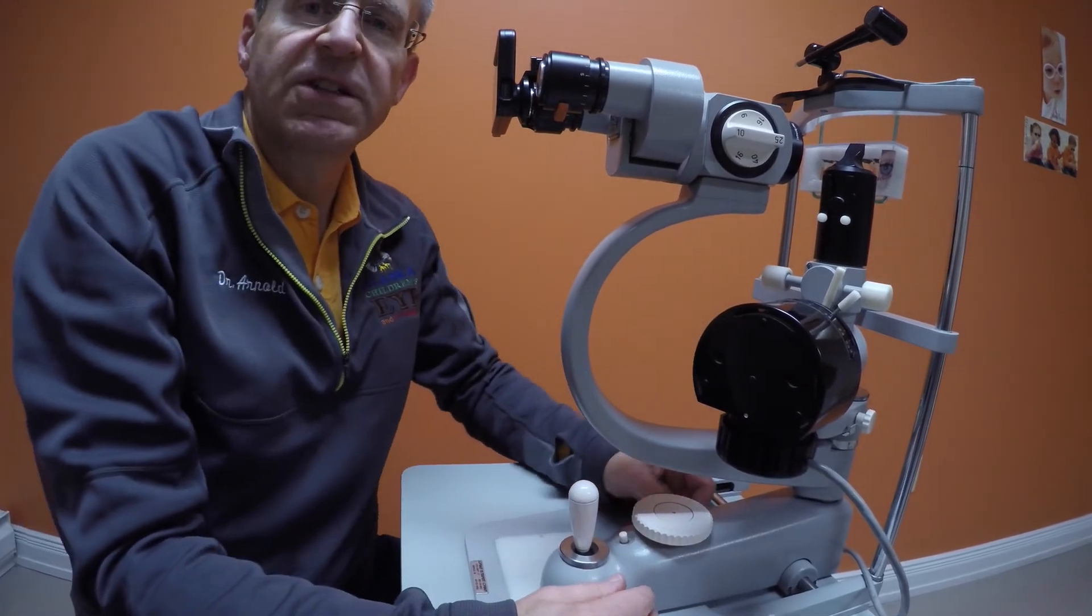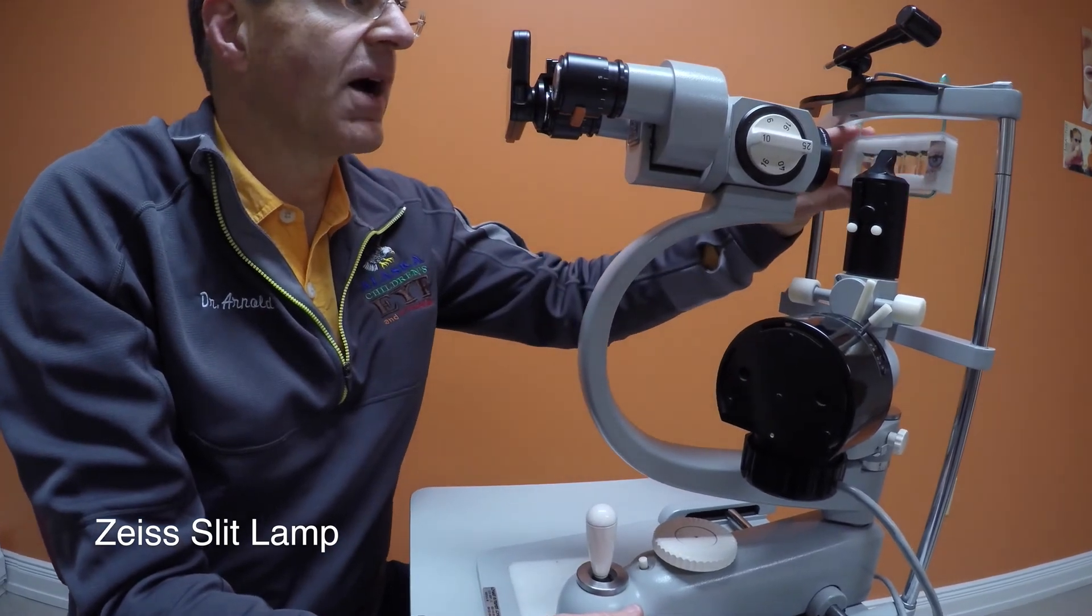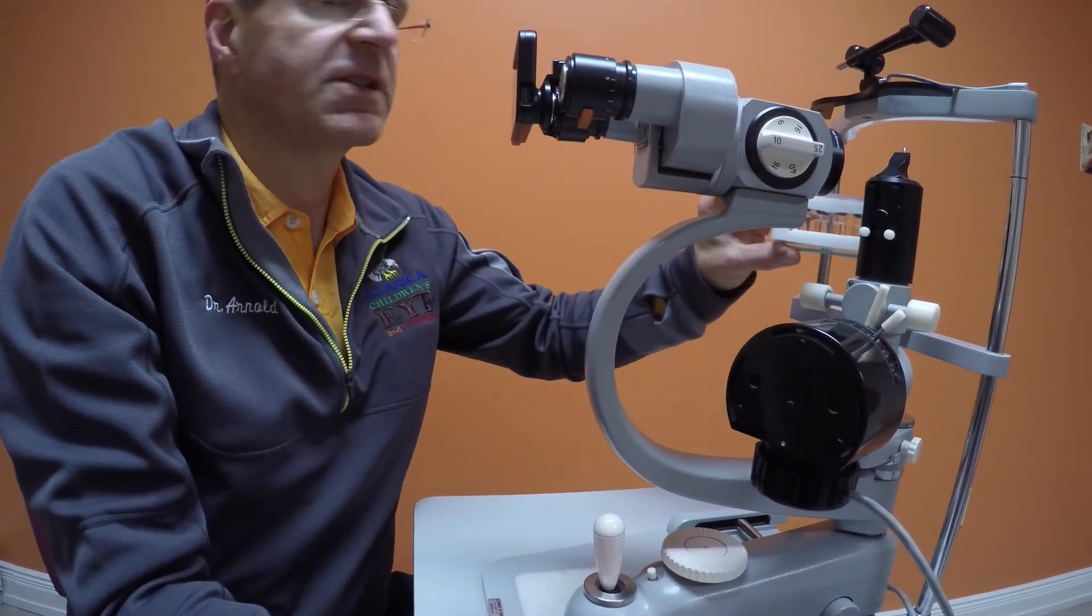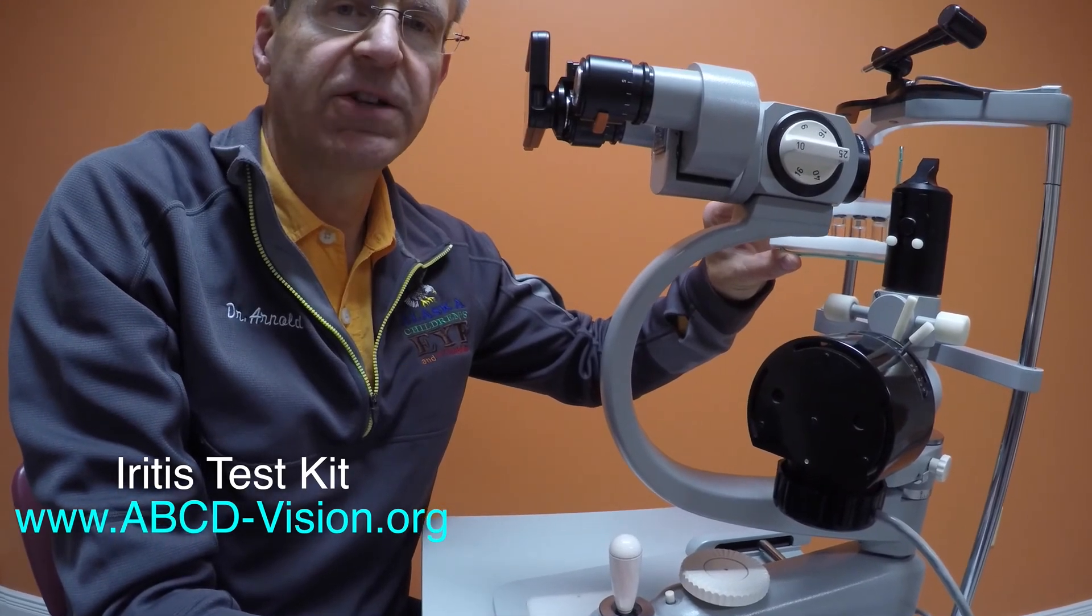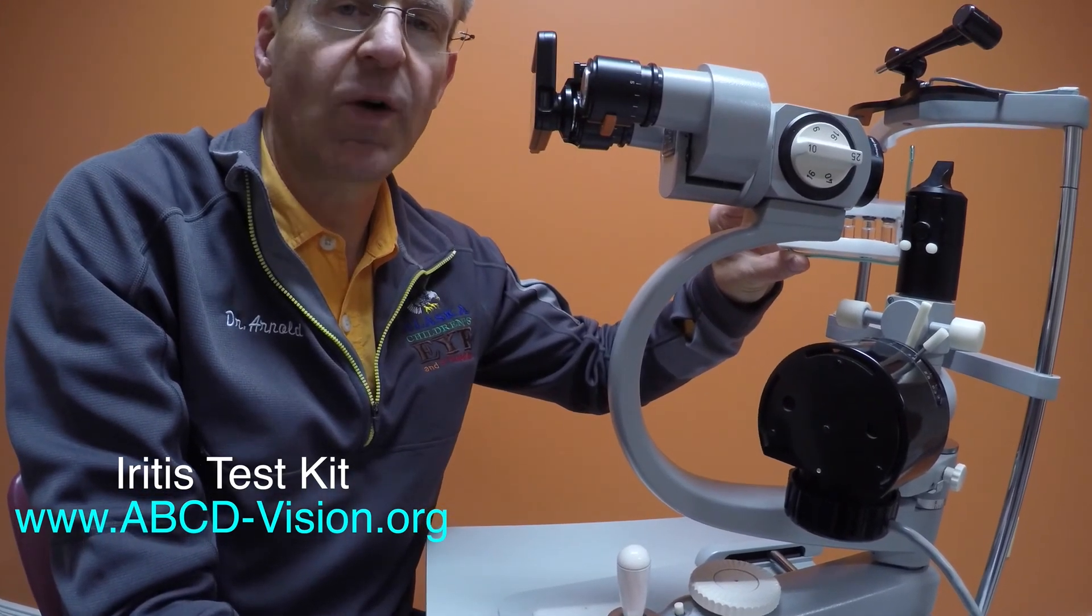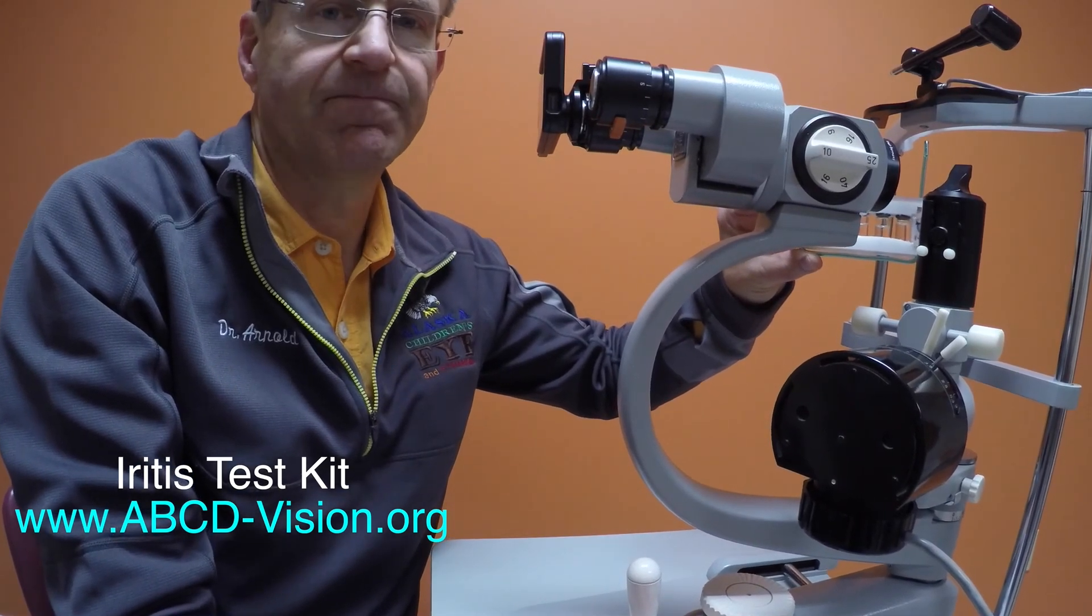We hope that this demonstration of a Zeiss slit lamp combined with an iritis test kit allows you to evaluate patients better for the presence or absence of white blood cells floating in the anterior chamber or iritis. Thank you.